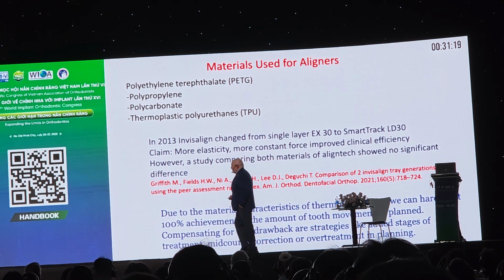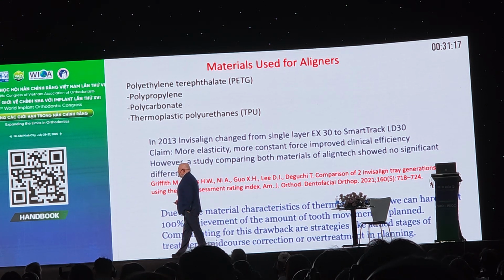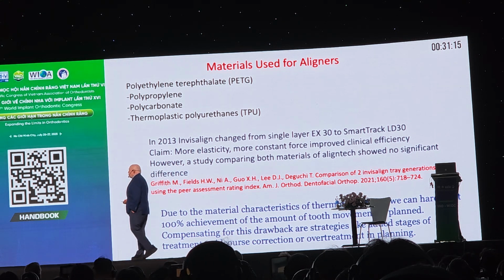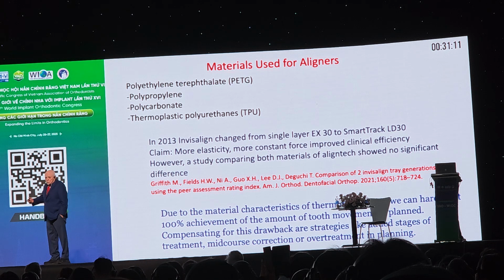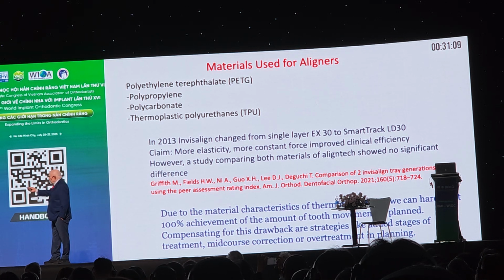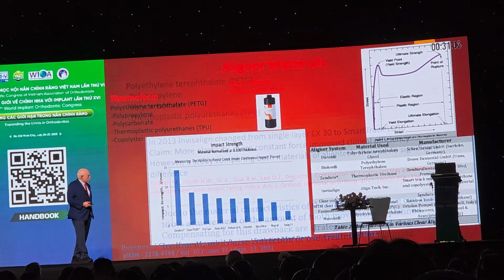This is a very nice study which came out because in 2013 Invisalign changed single layer to SmartTrack because they said force system is much better. The study came out in AJODO, which basically said there was not much difference between the two.